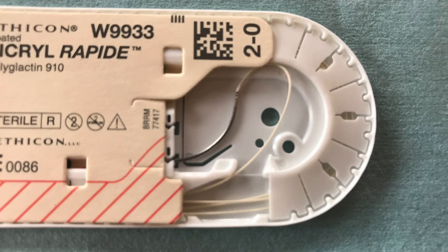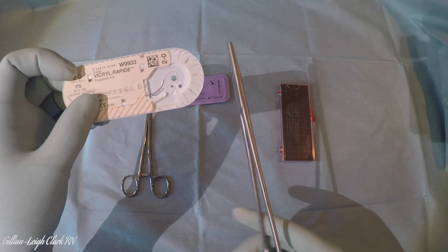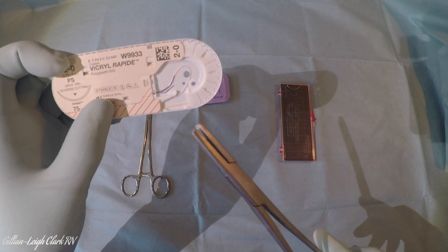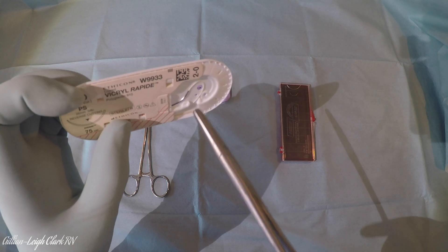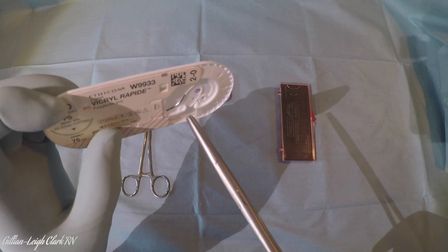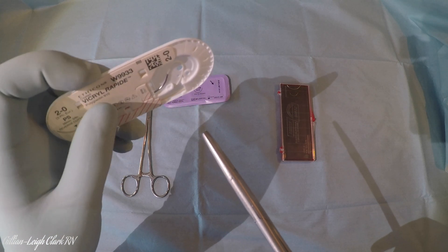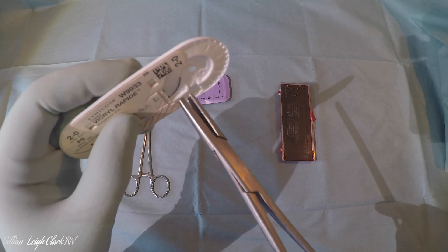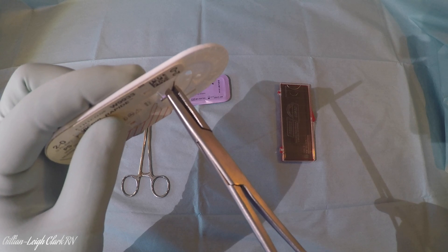If you look at this packet here you can see the needle and a little gap in the plastic underneath it, which means the plastic is moveable. Take the needle holder in your right hand because it's a right-handed instrument. What you want to do is get the needle holder onto the needle just in advance of where the suture material is attached, and far enough that there's just a millimetre or two of the needle holder on the other side. The easiest way is to hold the packet firmly in one hand, open the jaws, and push into the packet.